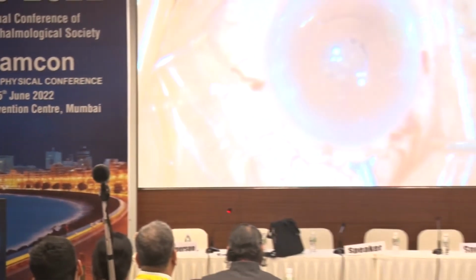This is a video of a posterior iris claw lens being implanted. The IOL is first placed on the iris. This will give us a clue as to where the claws of the haptics are likely to be. The AC is filled with a viscoelastic and there are special forceps which are used to hold the optic. There are two ways in which this can be done.